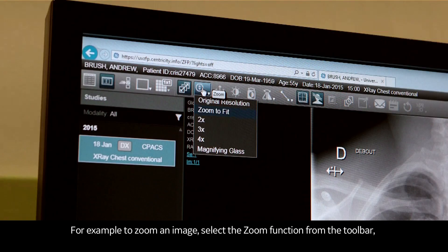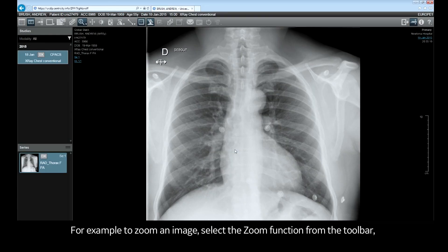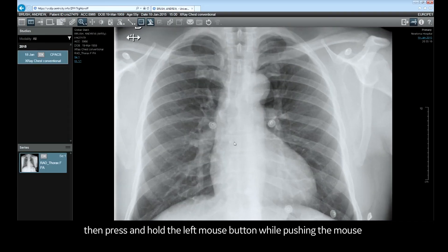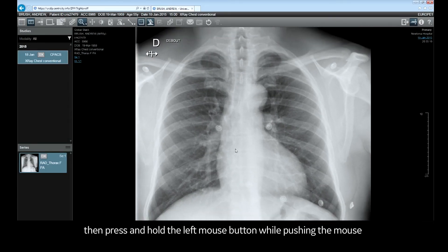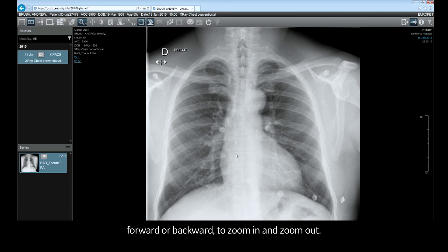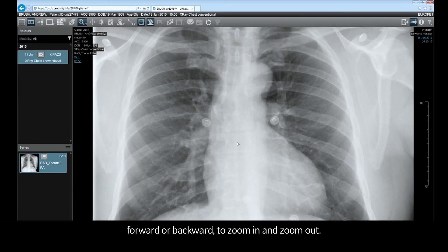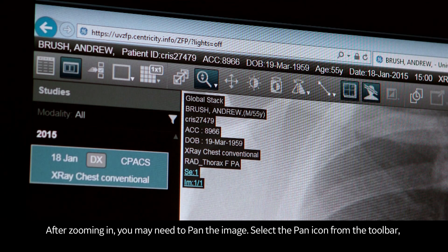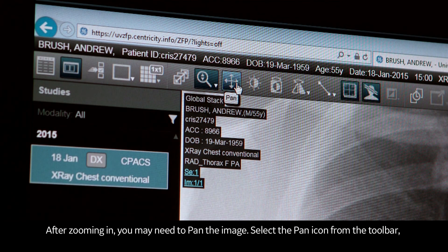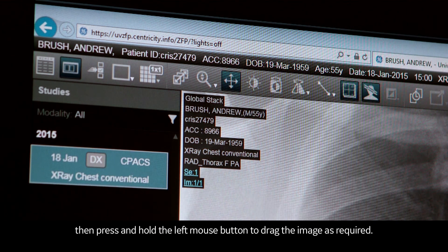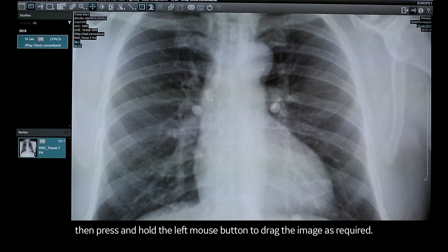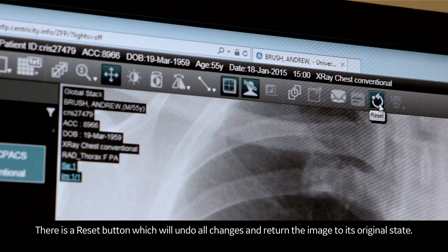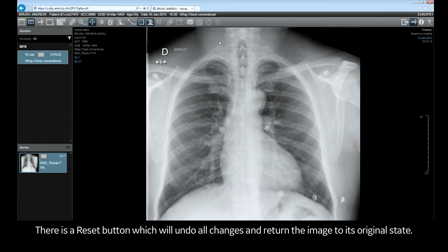To zoom an image, select the zoom function from the toolbar, then press and hold the left mouse button while pushing the mouse forward or backwards to zoom in and zoom out. After zooming in, you may need to pan the image. Select the pan icon from the toolbar, then press and hold the left mouse button to drag the image as required. There is a reset button which will undo all changes and return the image to its original state.